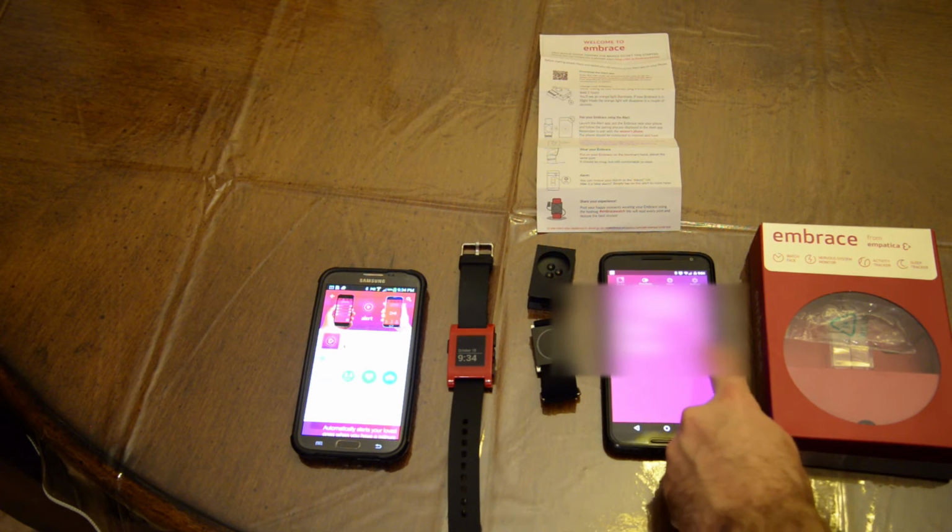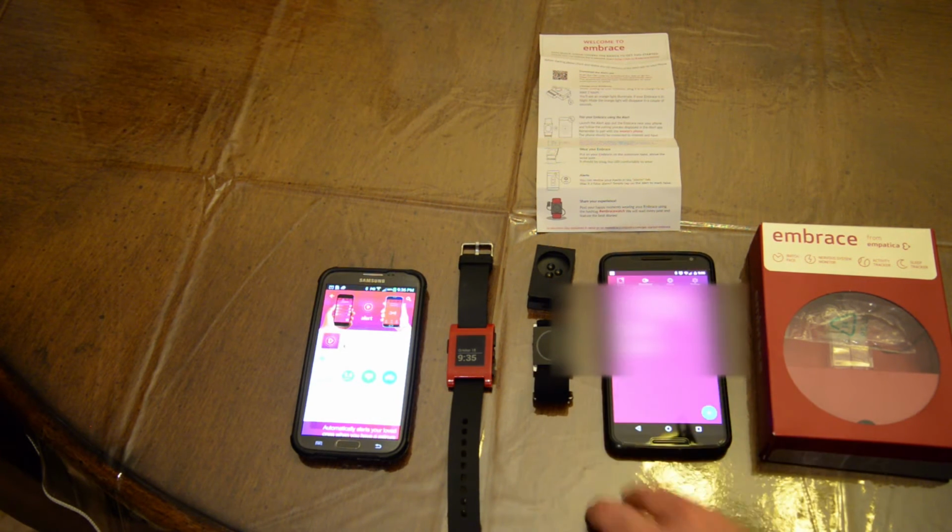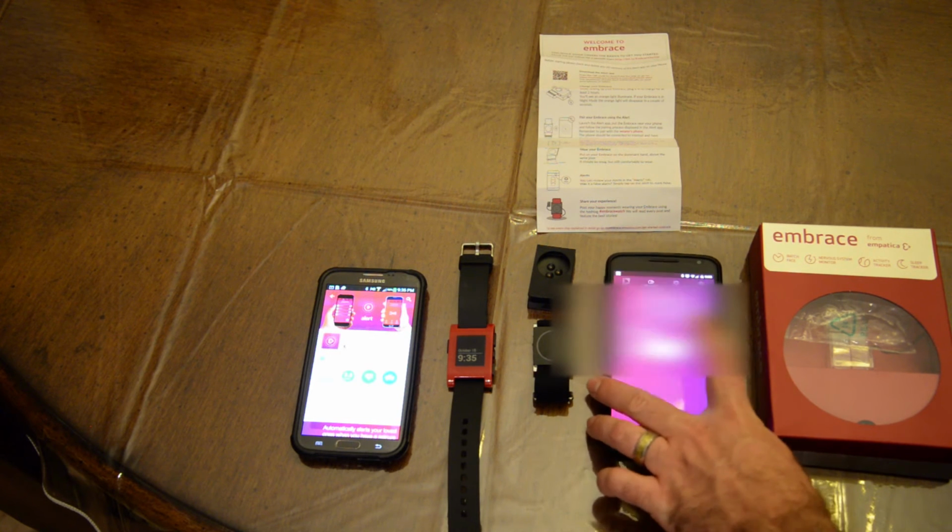So you just disable it by tapping it, by swiping it, whoop, like that, and it will save it and it will turn off, so the alerts are disabled, so I won't receive the call.